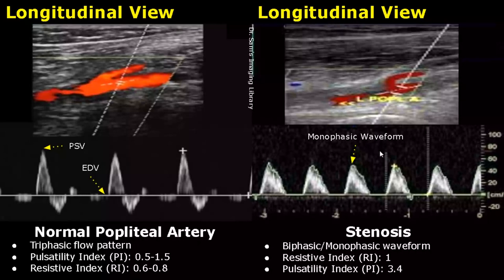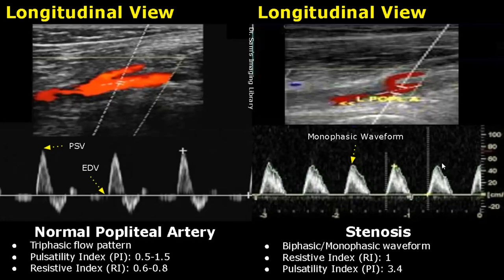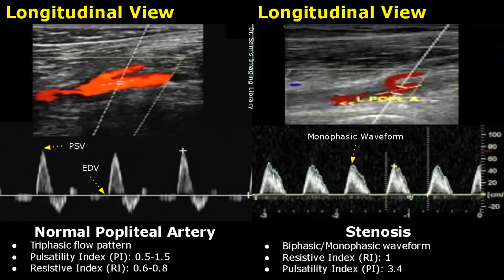Stenosis refers to the narrowing of the lumen of a blood vessel. There are various features seen on ultrasound regarding stenosis. The normal waveform can change to either biphasic or monophasic depending on the severity of the stenosis, and both the resistive index and the pulsatility index will be increased. In this image, the resistive index was 1 and the pulsatility index was 3.4, and it has a monophasic waveform — we only see one type of shape that is above the baseline.